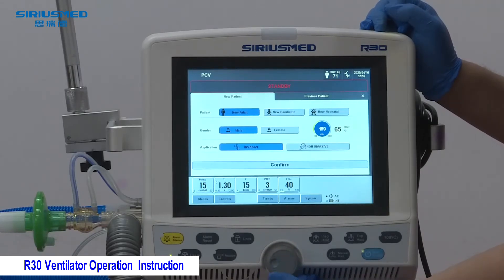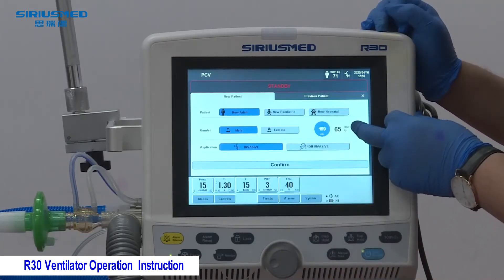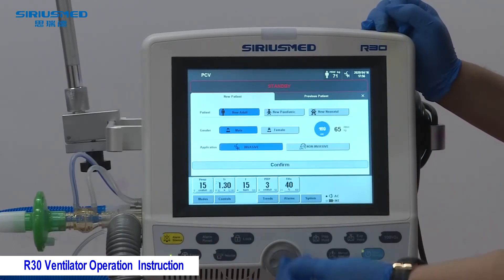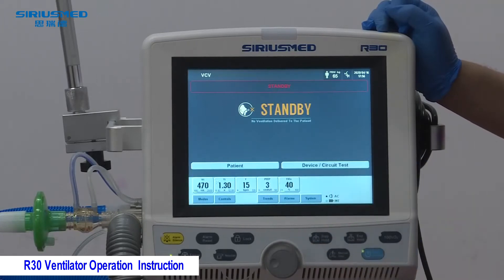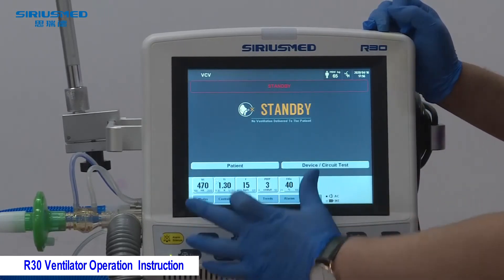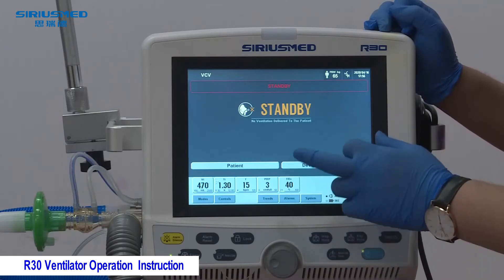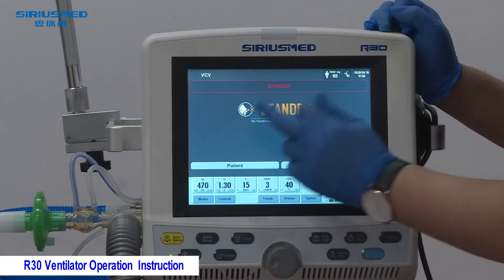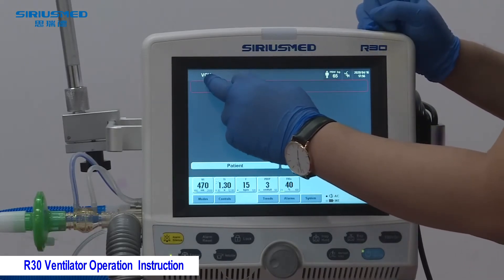Don't forget to press the knob to confirm. The machine will calculate the predicted body weight (PBW) of the patient. The doctor can then choose invasive or non-invasive ventilation and confirm. The ventilator will give a suggested parameter set, but these parameters cannot be used directly — the doctor must adjust them according to the patient's condition.